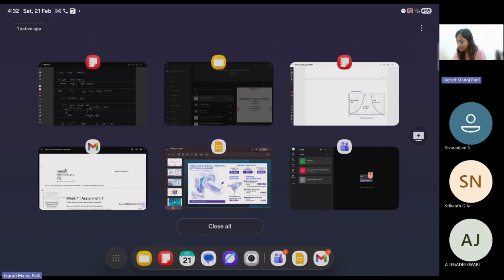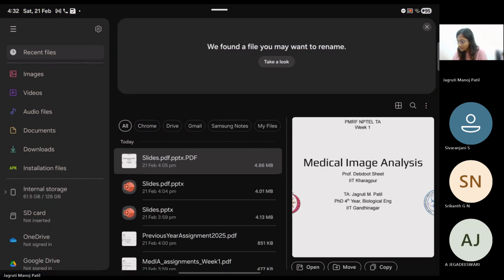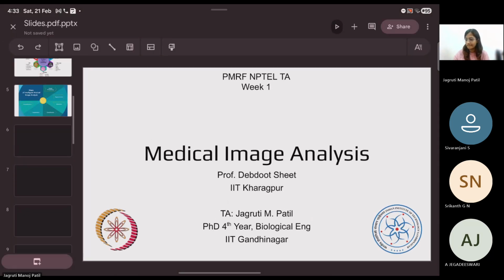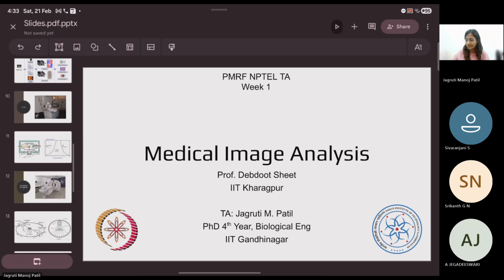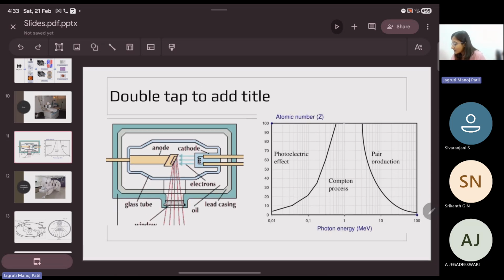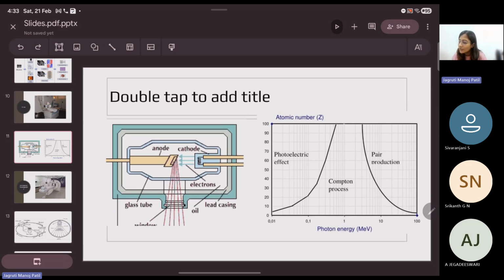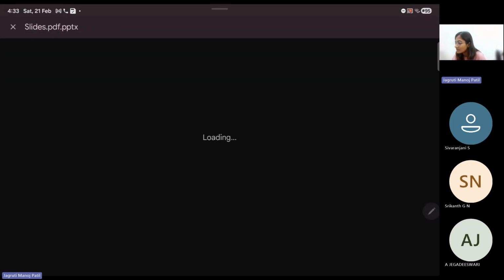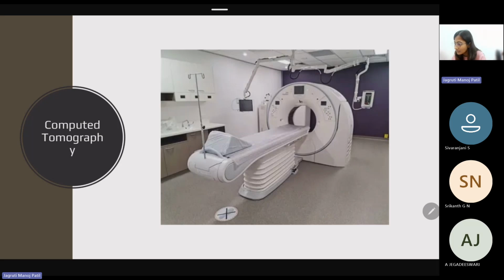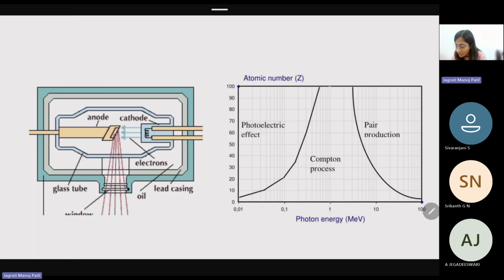Let's just open the presentation. Yeah. So here I won't be able to write on this because it's not allowing me to. But yeah, on the left you have an anode. Let me present it so it will be on full view. Yes. On the left you have this anode, and can I do a pointer? No. Okay. On the right, you see a cathode.